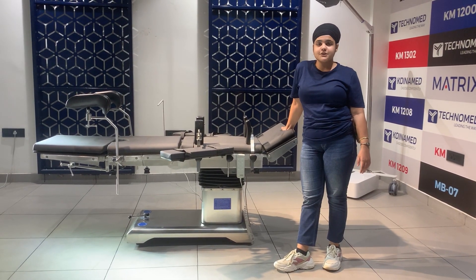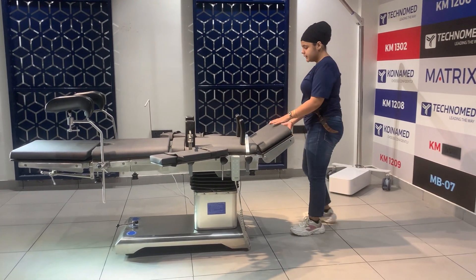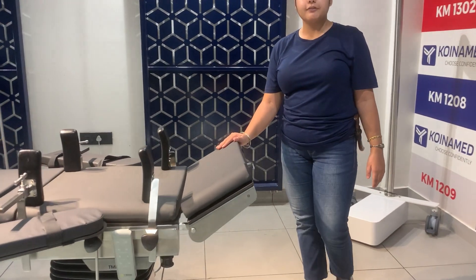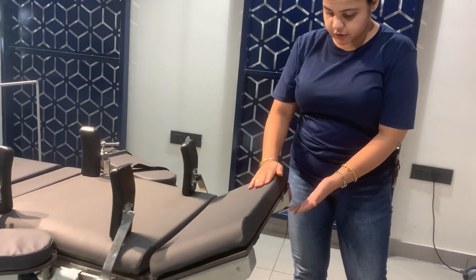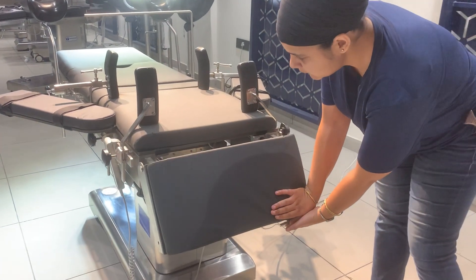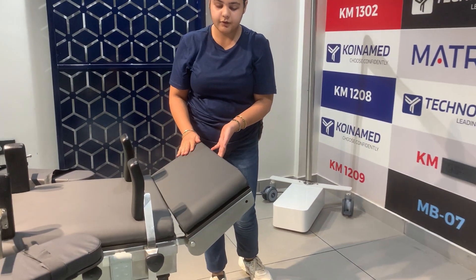These are the positions you can operate with the help of the remote. Now I will show you the gas spring feature of our table in the head section. We have provided a gas spring here, and by pressing it down you can see how smoothly it goes downwards — with the slightest pressure it comes down.